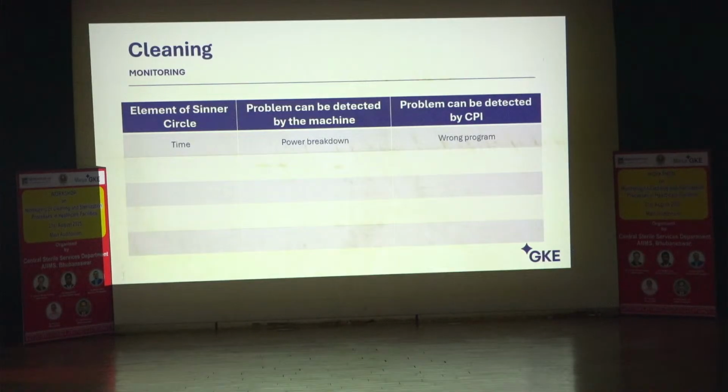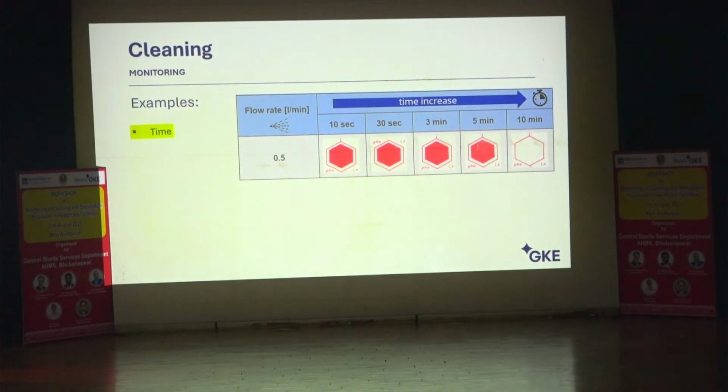And I get a telephone call or an email, your indicator is not washed off anymore and the machine is in perfect state. I even called the technician, and in the end we found out, well, somebody who did a job replacing somebody on vacation started the short program. And in this case, the indicator will tell you.